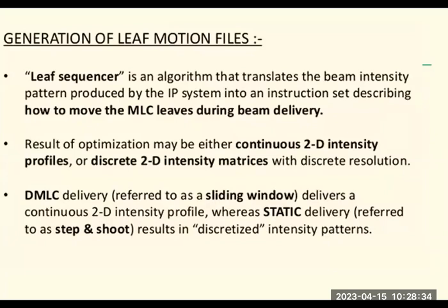That is what we saw in the morning class: how the tumor is focused from three different directions. When you do it with three different directions, you can focus the complete tumor. Those things are programmed, and accordingly the leaf sequencer will move.